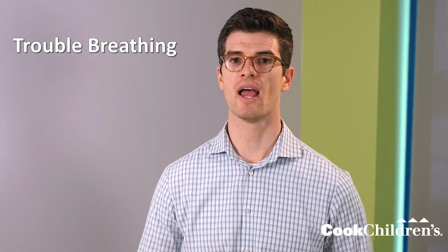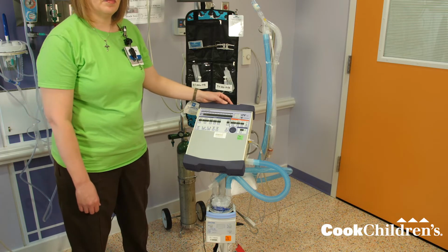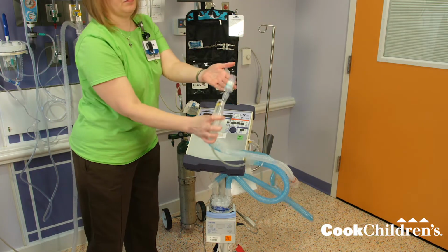Humidification is very important for children with a trach. They are not able to humidify or moisten the air they breathe normally. Lack of humidification can cause trouble breathing and other breathing problems. If the child with a trach is on a ventilator, humidification is provided in one of 2 ways. The 2 ways are with a heater or with an inline HME.